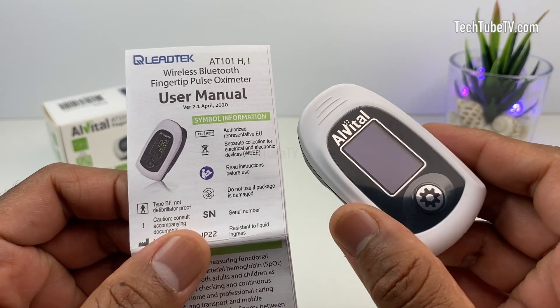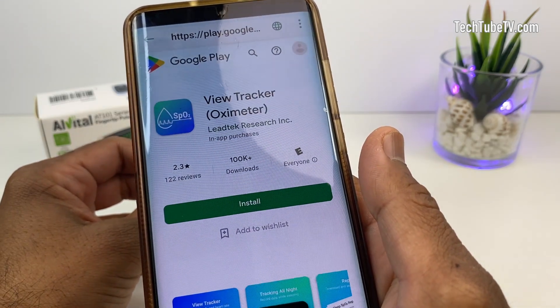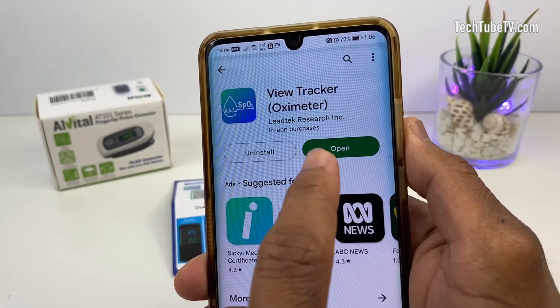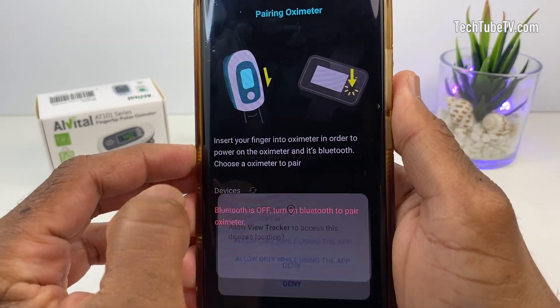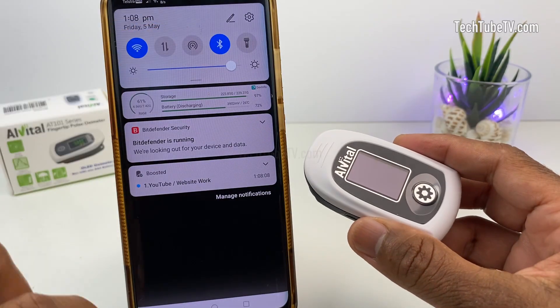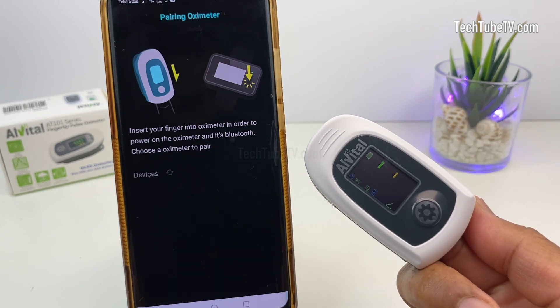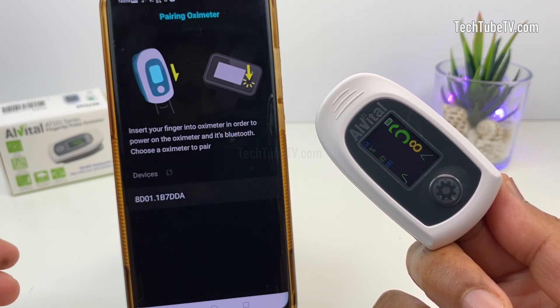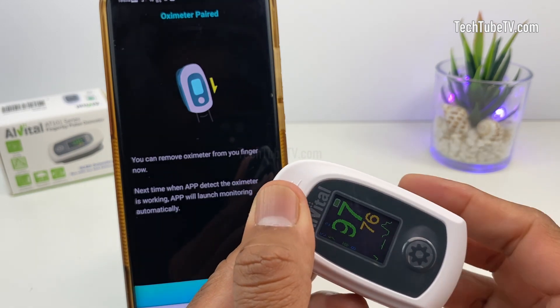Let's test this by using the pulse oximeter app. Scan the QR code on the provided card to find the right app. Install the app from Lead Tech Research and launch it. Read and agree to the disclaimer notice, then choose your location access preference. Currently Bluetooth is off — turn on Bluetooth and insert a finger into the oximeter. The oximeter will turn on automatically and show readings. On the app, click to refresh the devices list. Once the device is detected, click to select it. You can now remove the finger.